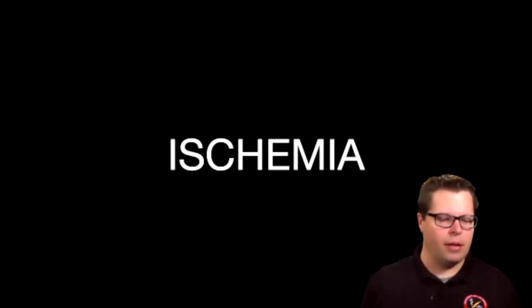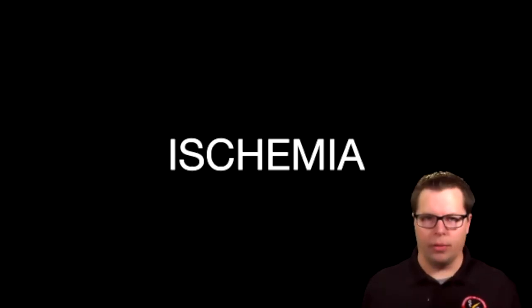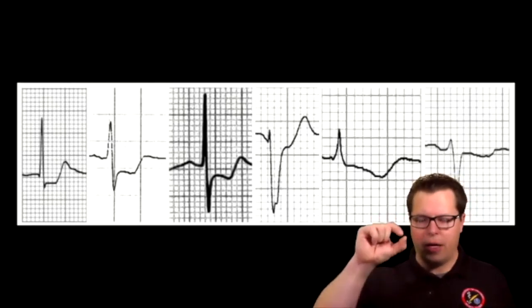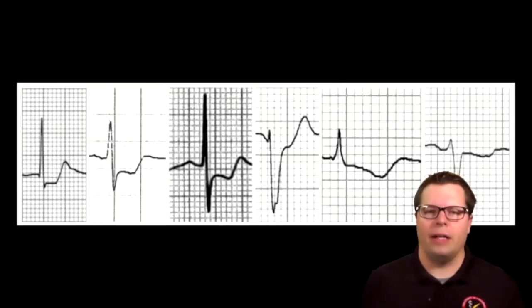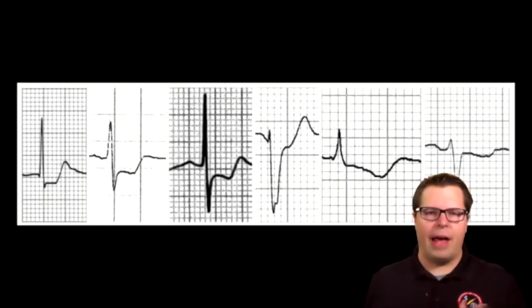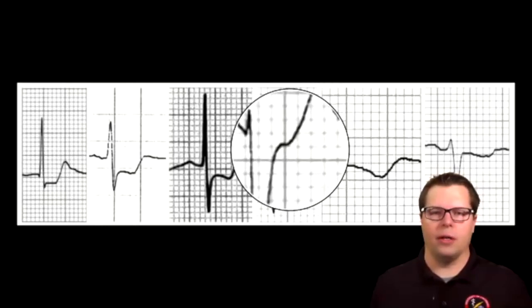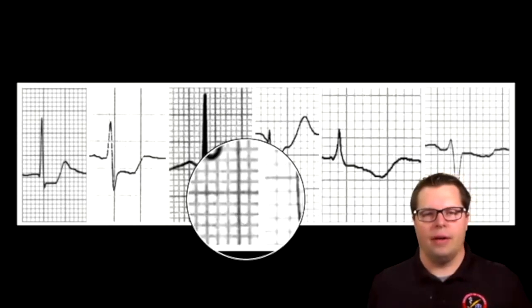What does ischemia look like on an EKG? It is ST depression, generally speaking, and an ST depression of a magnitude of about 0.5 millimeter, or 1/2 of a small box, which is a little bitty bit, is significant. There are different morphologies of ischemia. The flat ones and the downsloping ones, like that one. So flat, you see how there is ST depression here. See how that's kind of flat? This one has a little bit of a slope down.